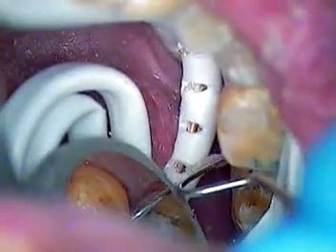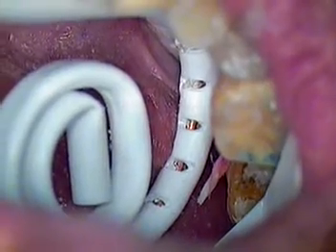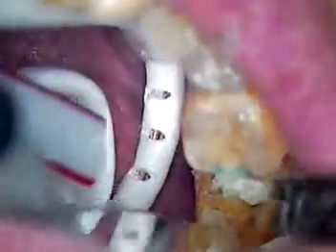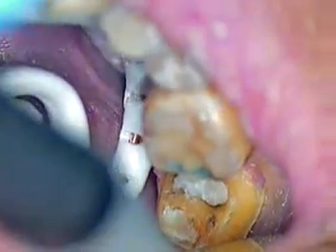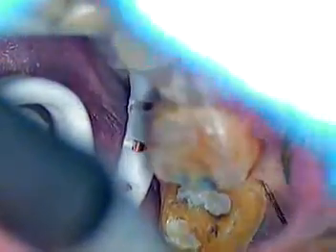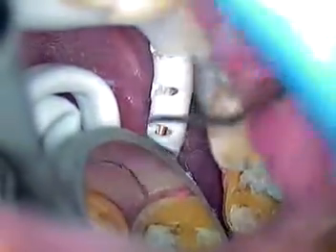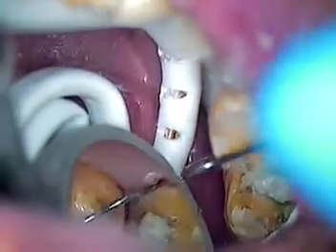At this point we'll bring in a little bite block made of styrofoam for our patient so he can rest on that. Now I'm going to leave that cord in there — I'll just cut a piece of it off and have nothing showing, so we can go right to the impression. There's a special paint-on material I have to use for the AquaSil — just a small amount on the surface of the tooth, which helps with surface tension and gives us a better final impression.